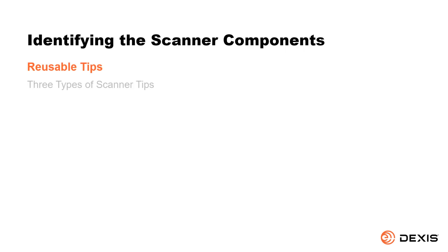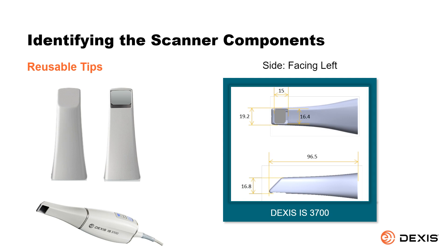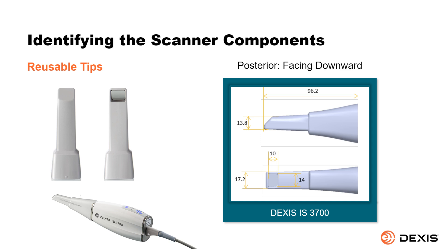Reusable tips. There are three types of tips: Normal, facing downward; Side, facing left; and Posterior, facing downward. The posterior tip allows for more comfortable scanning in hard-to-reach areas. The posterior tip is designed for quadrant scanning only and should not be used to scan a complete arch.